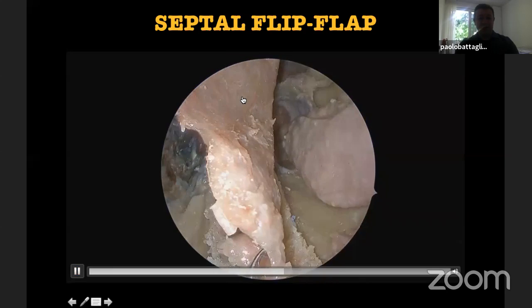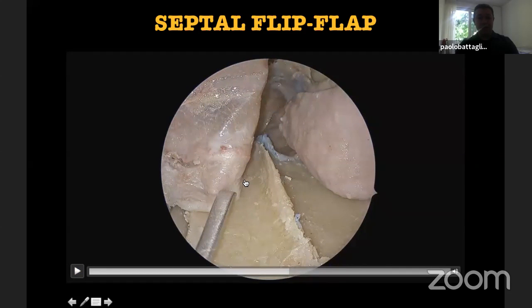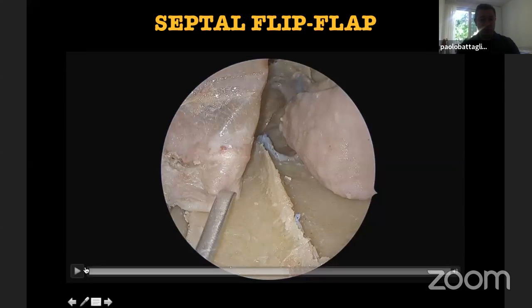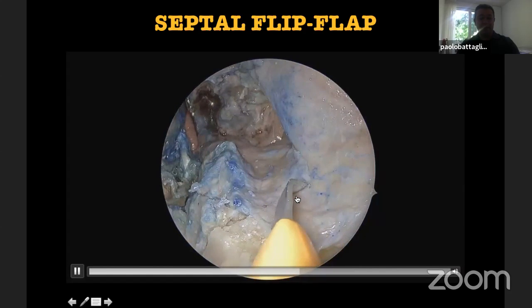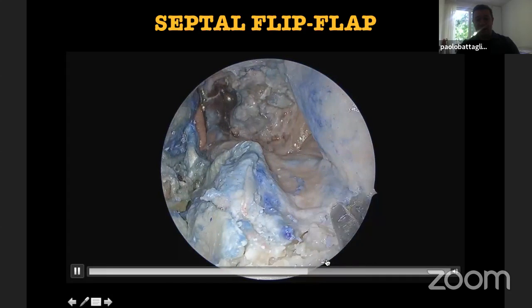Okay, so we detached anteriorly. Now it depends how large you need the flap to be. You can cut just here where the septum becomes nasal floor, or laterally, and you can also extend the flap till the inferior meatus. And then I will show you how huge a surface this flap will cover. So we go posteriorly till the insertion of the soft palate at the level of the hard palate.